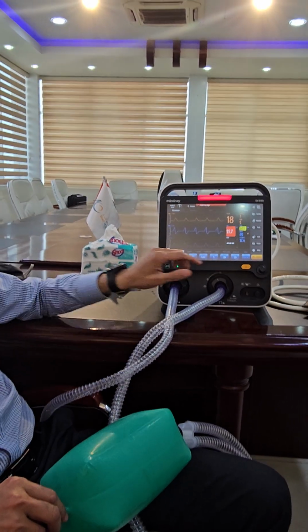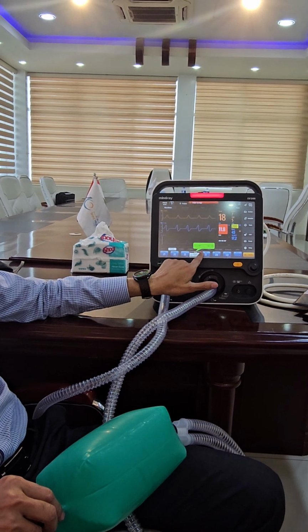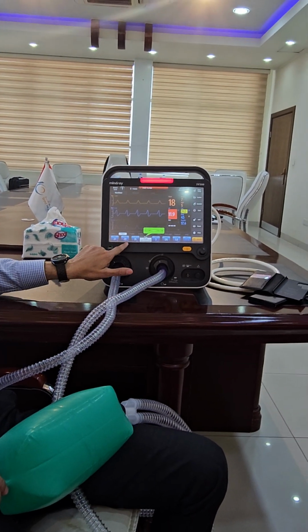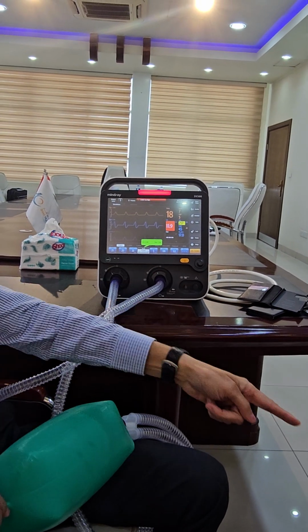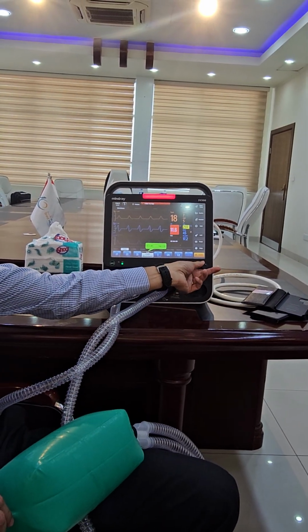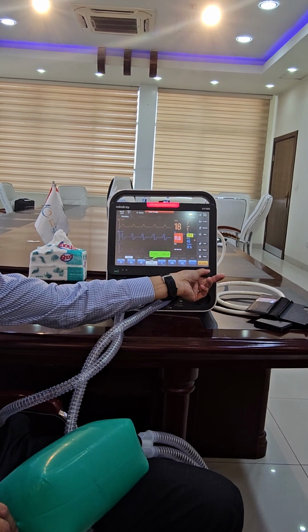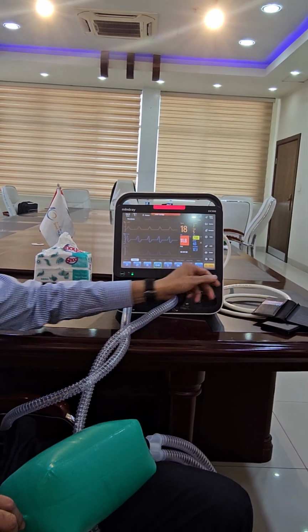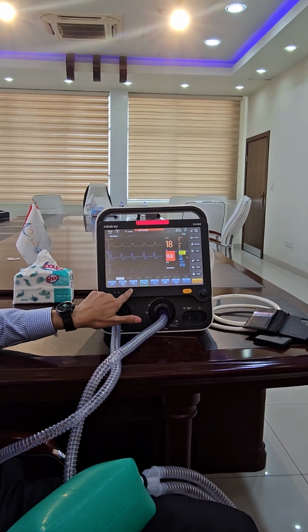You understand? So if you want to do 1 to 2, you either decrease the inspiratory time or decrease the rate. You cannot do both because you exceed the time. So let's decrease the inspiratory time to 0.5. Even 0.5. Let's say 0.4. Okay, now let's repeat. 35 times 0.4.